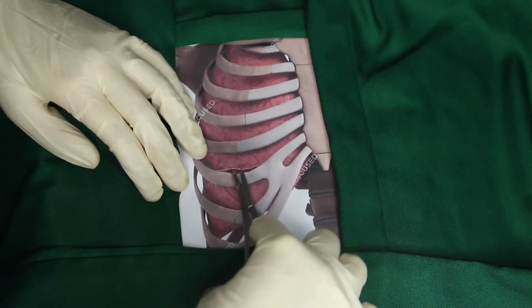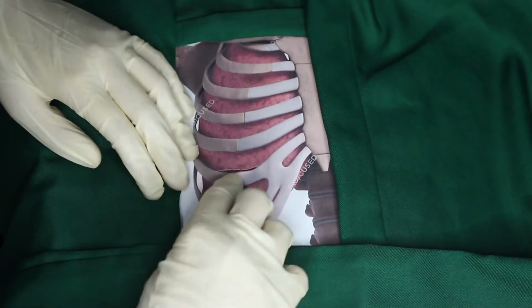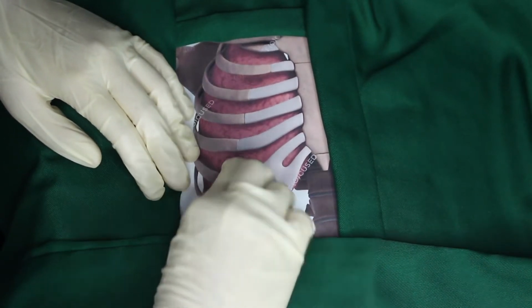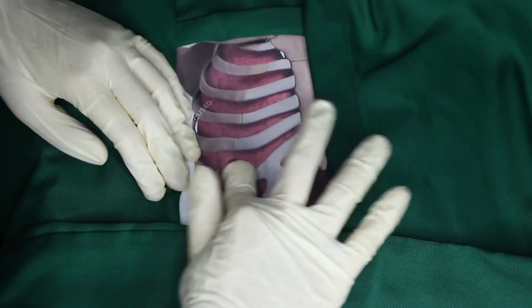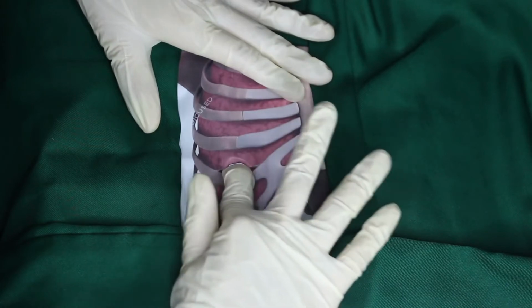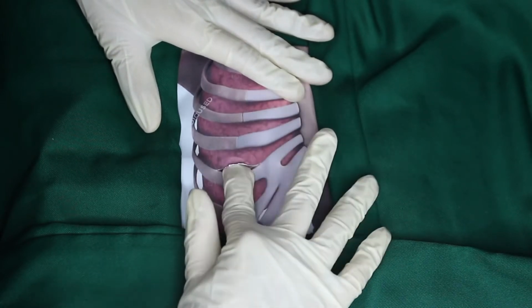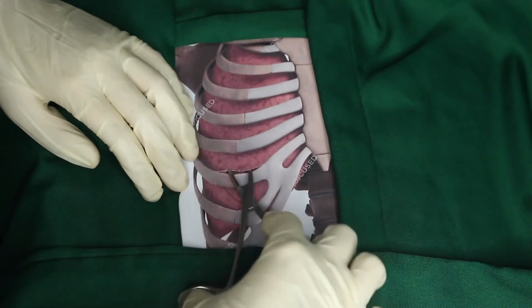Continue developing this tract all the way into the pleura. Remove the clamp and explore the tract with a gloved finger from time to time to make sure the tract is going in the right direction. After the pleural cavity has been entered, insert the gloved finger to explore for adherent lung and then further enlarge the opening in the pleura by inserting a large Kelly clamp and spreading it.